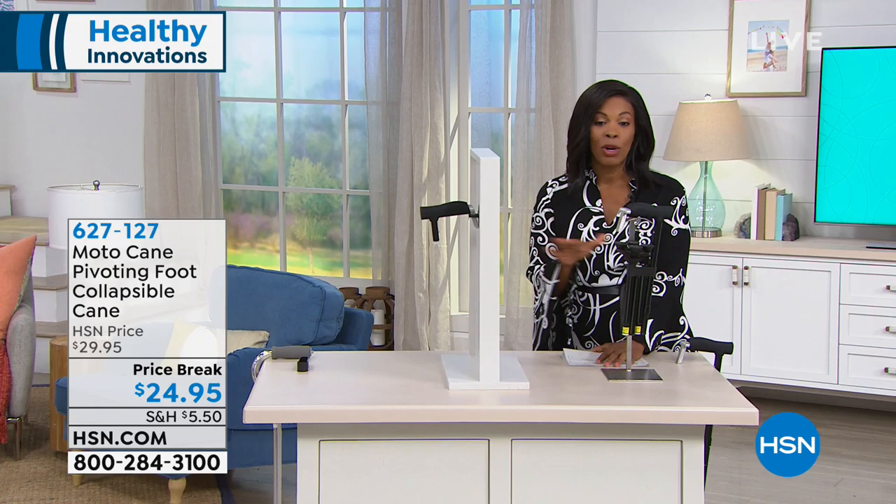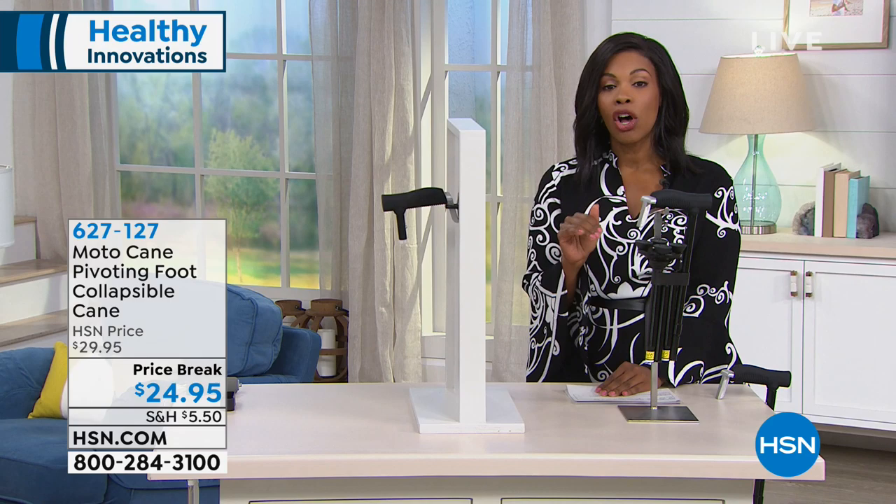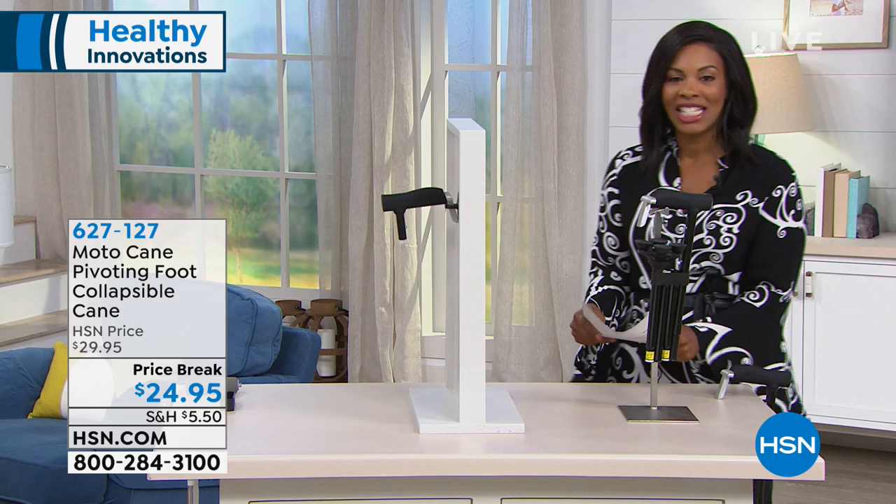You've got a price break — $24.95 — a great price for what you're picking up. We haven't had this on air since January, so I'm glad we've got it for you right now. Vonnebel Sherman is joining us, and she's going to give us all the details on our Moto Cane pivoting foot cane.